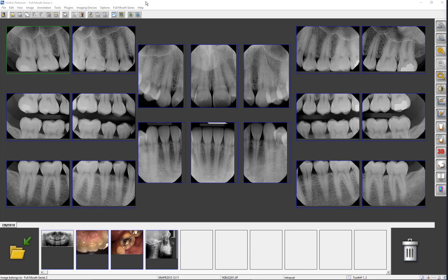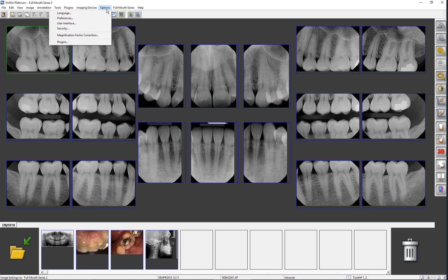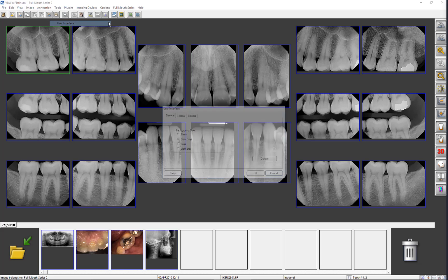Welcome to a Gindex video training series that demonstrates the functionality of VixWin Platinum 3.5 imaging software. This tutorial will show you how to configure the background color, toolbar, and sidebar of your VixWin Platinum software to fit your requirements. To begin, let's click on the Menu Bar Options tab, then on User Interface.